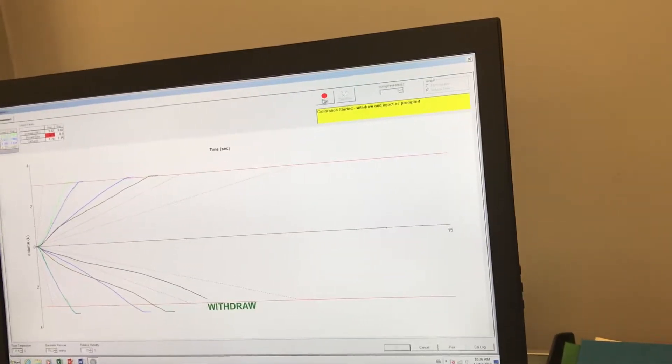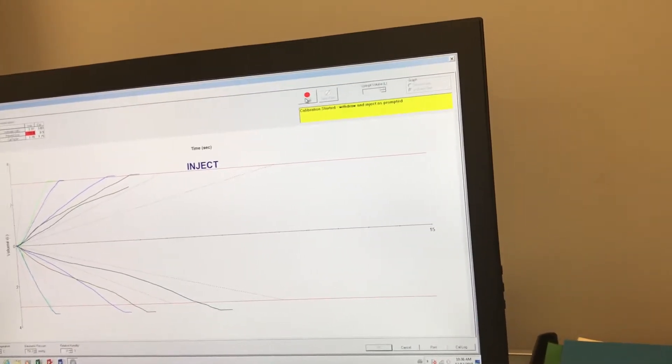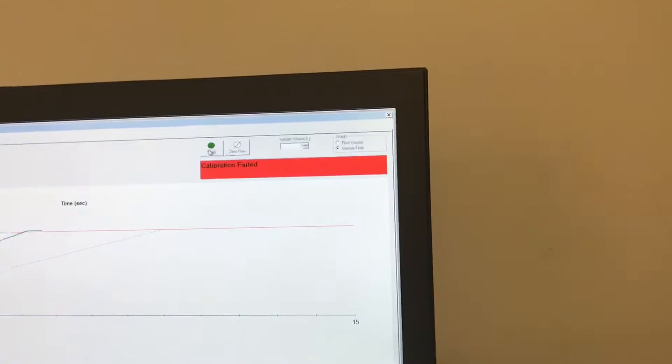After each withdrawal, slight pause, inject, and slight pause. If you don't do that slight pause, you're going to fail calibration for sure. And as you can see, it says calibration failed.